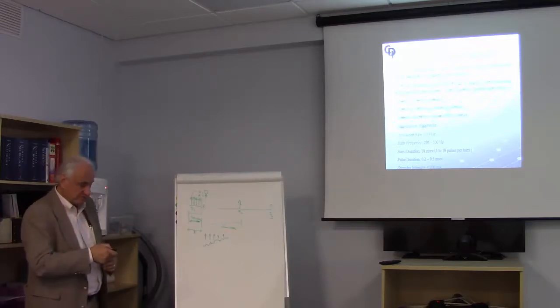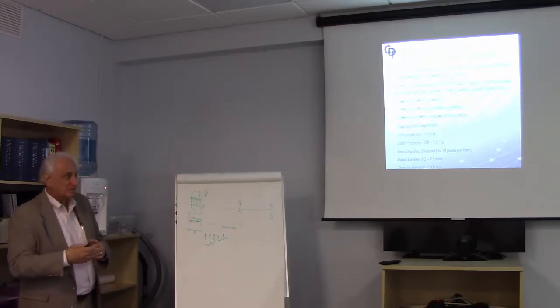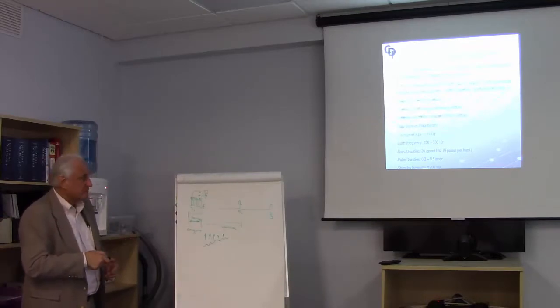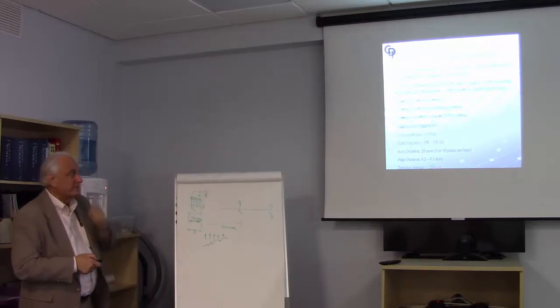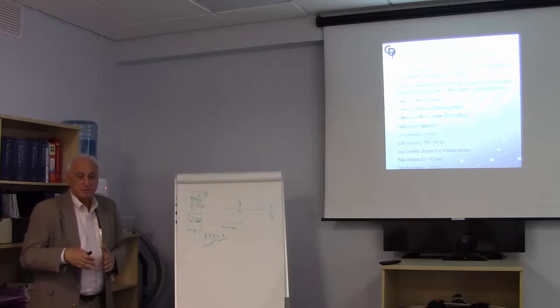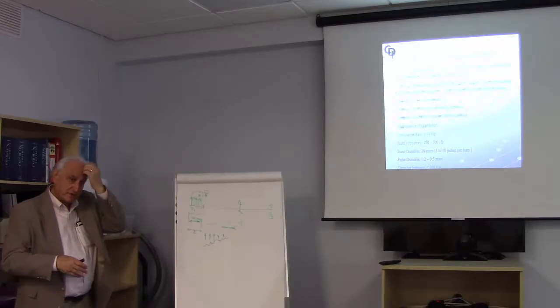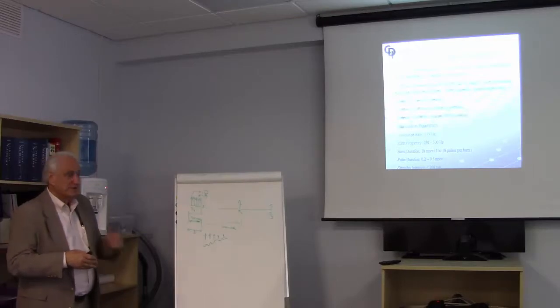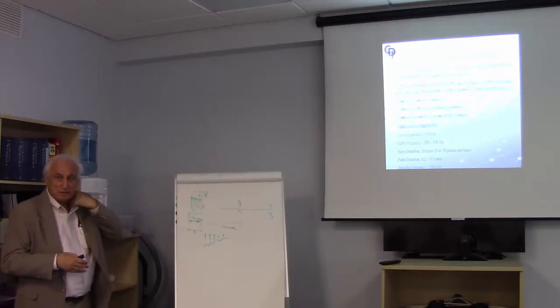So this gives you a reasonable number of electrons being transferred to excite things, but not so many that you can hurt the patient. And then the maximum intensity will go up to 200 milliamps. I think in the United States there's an organization, the FDA, and they approve things. The highest value I've seen them approve is 1,000 milliamps.